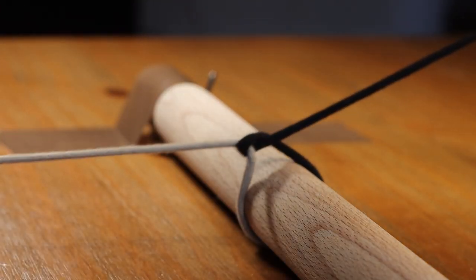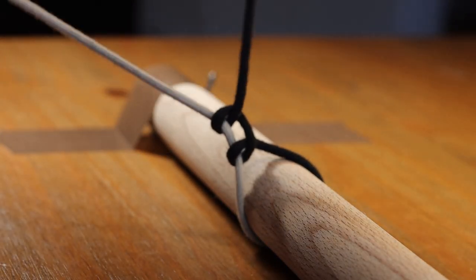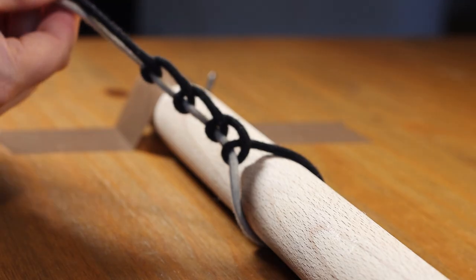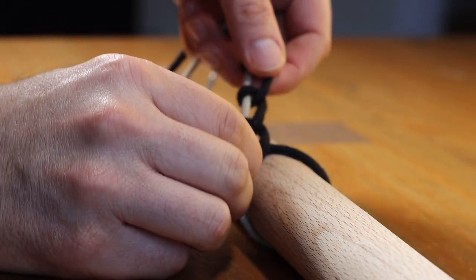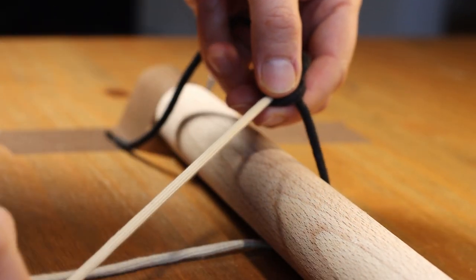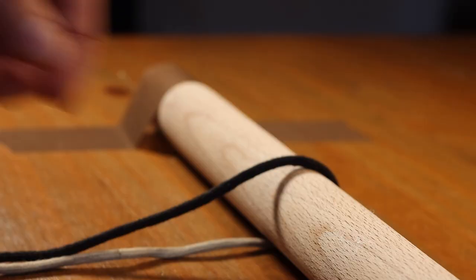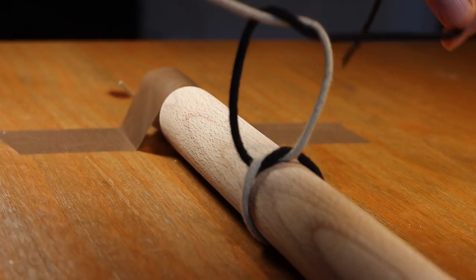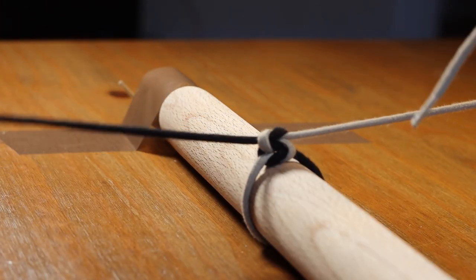What I'll show you now is what happens when you only learn one of the throws. If you only do one tie at a time you end up with a slip knot, as you can see here, and it's called a slip knot because it slips right through and therefore the blood vessel just bleeds again later. Now compare this to the correct technique and you'll see that the knots come down very nicely, very neatly — there's going to be no slippage at all here.